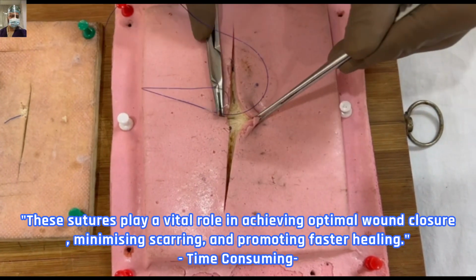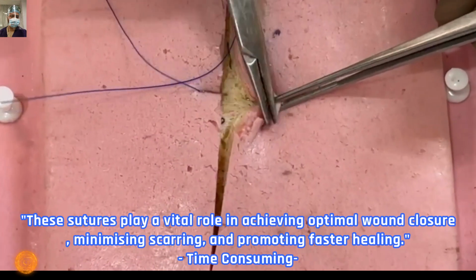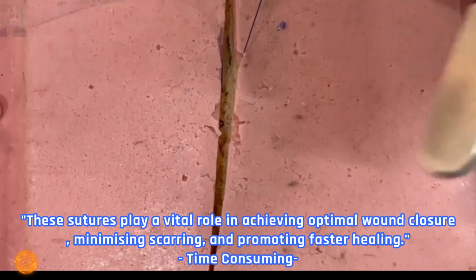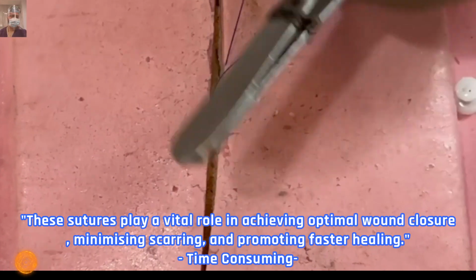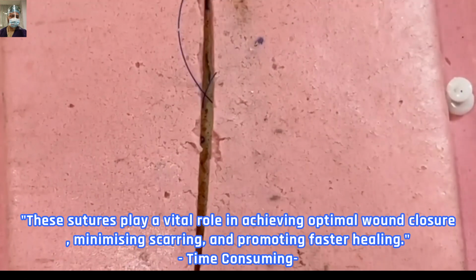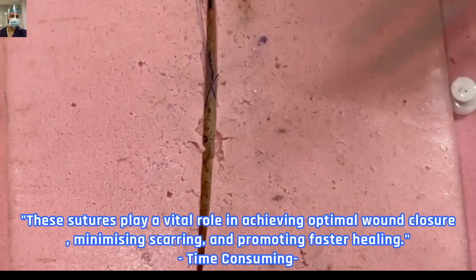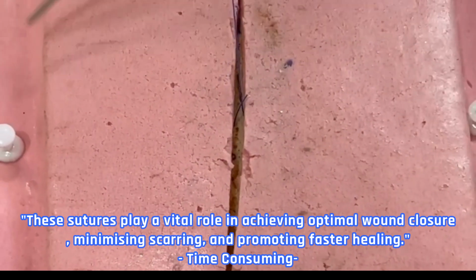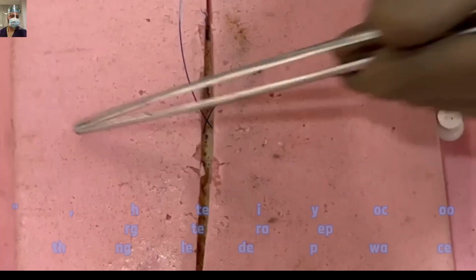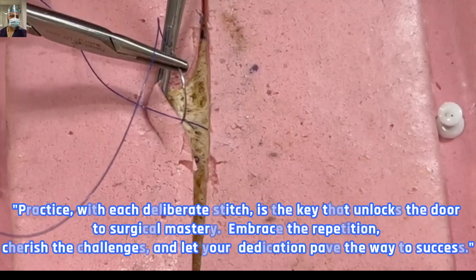Another benefit is that with the suture placed beneath the skin surface, you can close the whole skin surface like a simple buried suture, and there is no need to apply a suture above the skin, so there is no visible suture, and above that you can simply close with the help of glue. It is an advanced technique used in surgical procedures to achieve precise wound closure by minimizing the visibility of suture on the skin surface. So it is another technique that must be in the armamentarium of all surgery trainees.